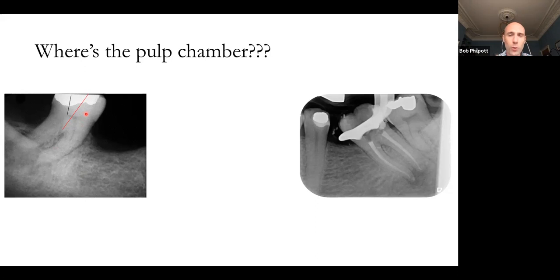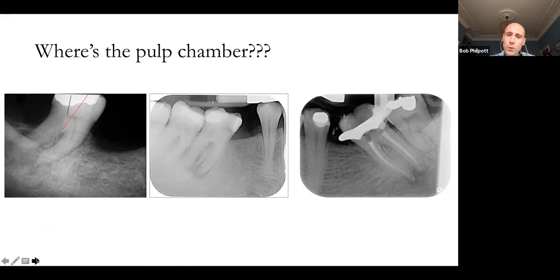So for me, I don't want to overcomplicate it. And in terms of the lines or the measurements that I take, I do try to keep those as simple as I can. If you look at this tooth here, this is a tooth that was referred in for canal location. I can't remember this. I think it was to the EDI. But actually looking at this, the shape of the access cavity is not bad. It's quite a decent size. You can see that it's a good depth because it's sitting right on the roof of the pulp chamber, but it's just that the orientation of the access is not correct.